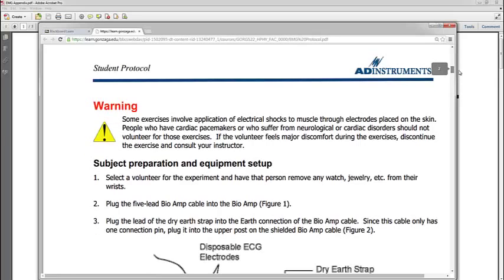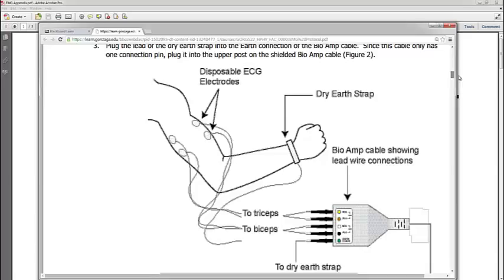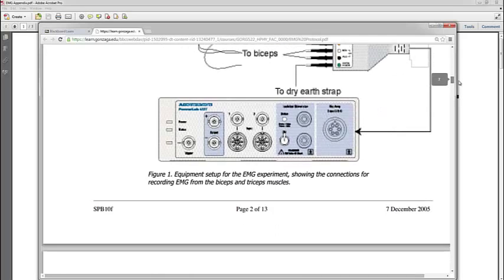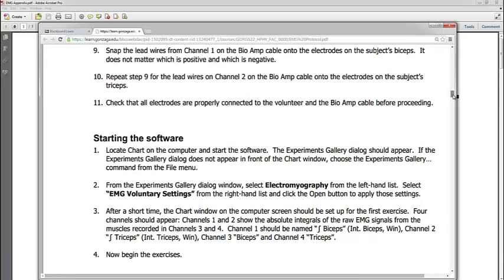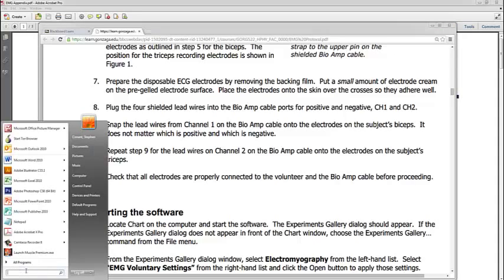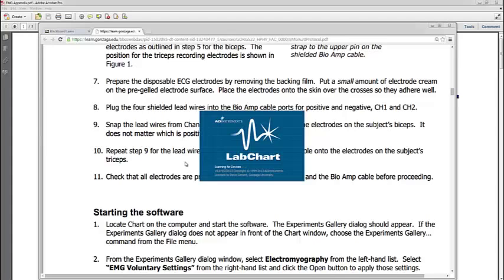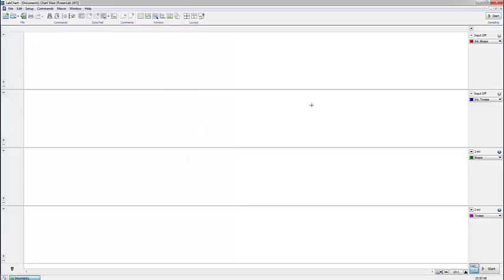For the first exercise, I'll walk you through this. We're looking at the components hooked up to the subject: the disposable ECG electrodes, the dry earth strap. Make sure you're bringing the right channel to the right muscle and have a positive and a negative on each of the muscles — confusing them will give you an odd signal that won't be worth anything. I open the software by typing in 'EMG voluntary settings,' LabChart opens, I click OK, and there I have a nice green arrow because I've hooked up the system.